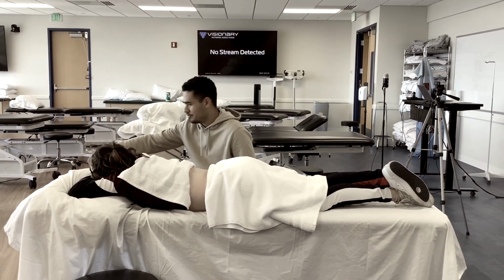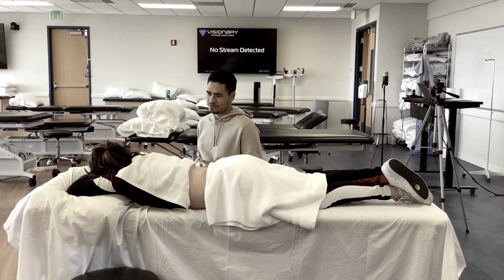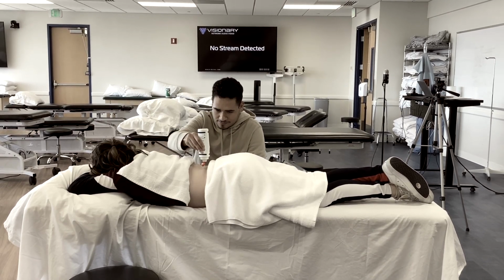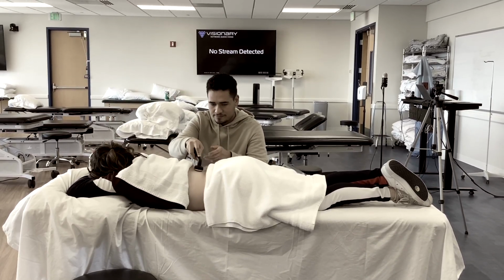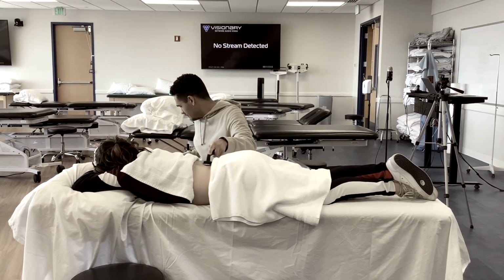All right, so what I'm going to do is put some gel on the area. It's just going to help with the ultrasound. It is going to be cold at first, so I do apologize, but we'll try and get it warmed up real quick. Turn on the machine.